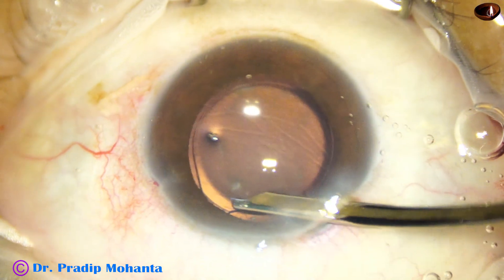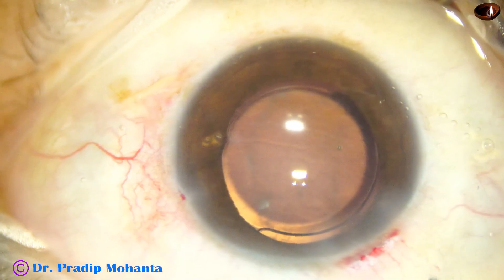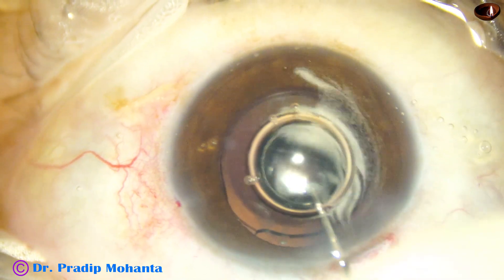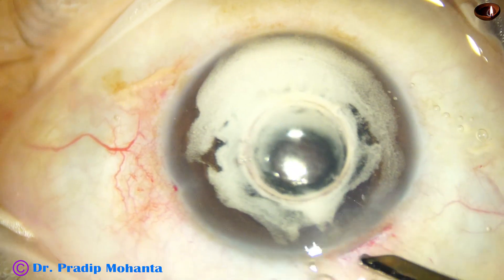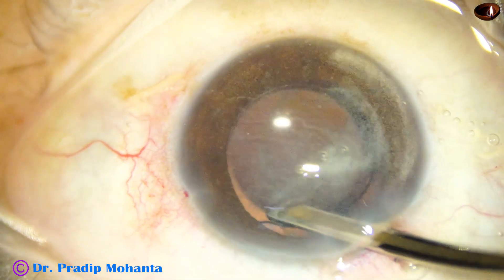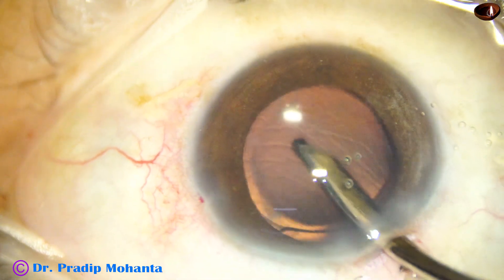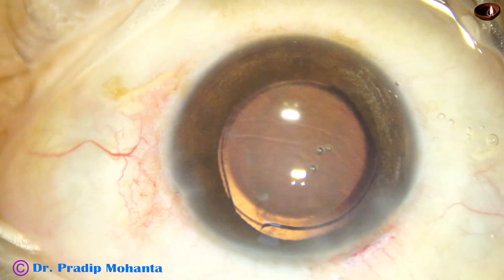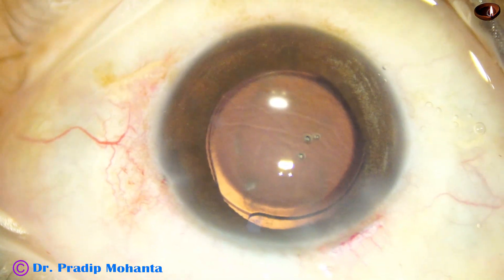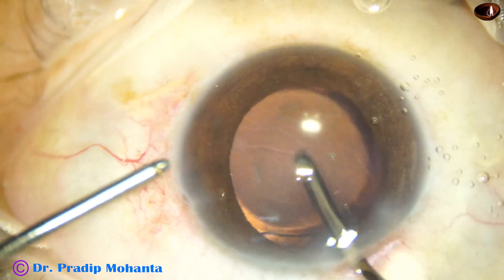Fortunately, the turbid fluid has not gone behind — when turbid fluid comes into the anterior chamber, sometimes it goes behind and the anterior vitreous becomes opaque. That has not happened in this case. I am now injecting a little triamcinolone, checking for any zonular defect at any site. This triamcinolone will also help reduce inflammation, as some molecules will remain even after washing and aid in reducing post-operative inflammation.